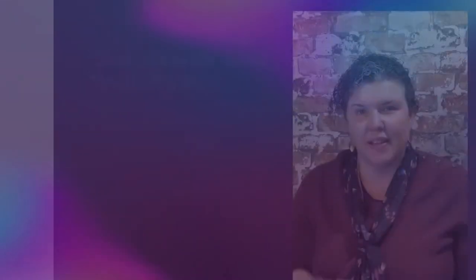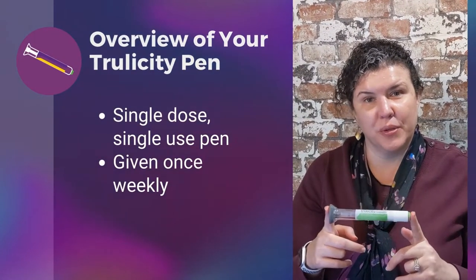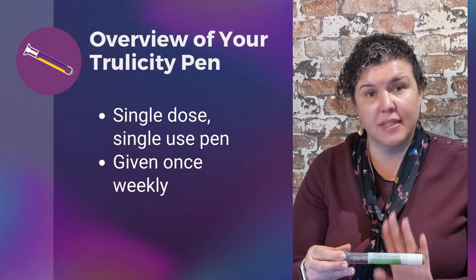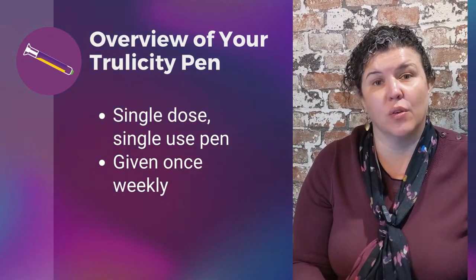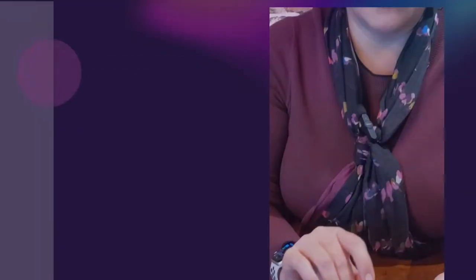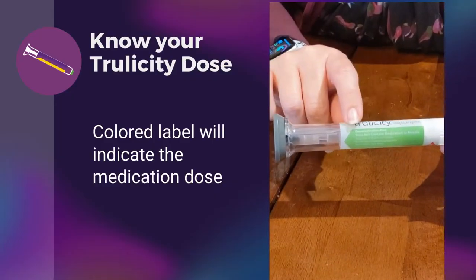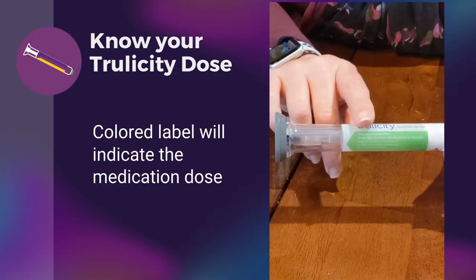So now I'd like to give you an overview of the Trulicity pen. This pen is a single dose, single use pen that is given once weekly. One thing I'd like to point out here is this ribbon that's now green. This signifies the various doses of the Trulicity pen.